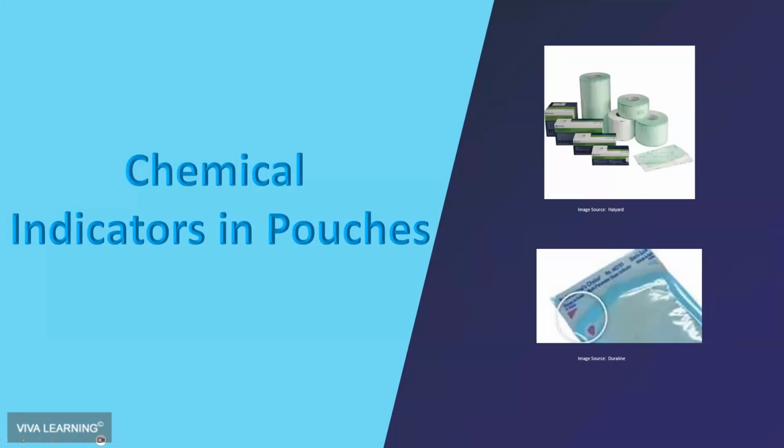Many people are of the understanding that autoclave tape is an indicator of sterilization. Autoclave tape is only a process indicator. It only means that something has been processed in the sterilizer. It does not mean that the instruments have met all the parameters needed for sterilization.